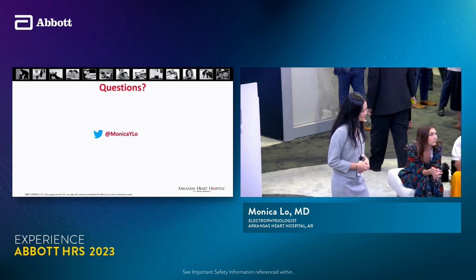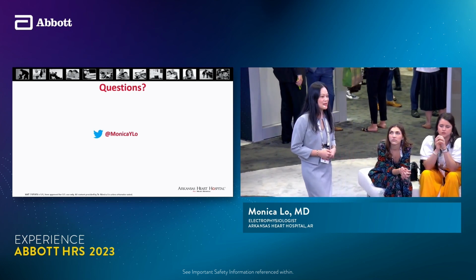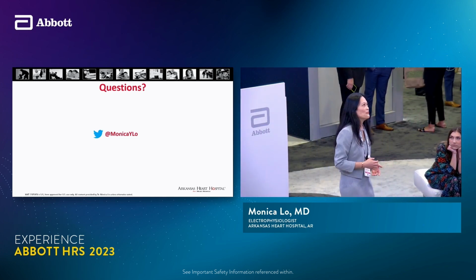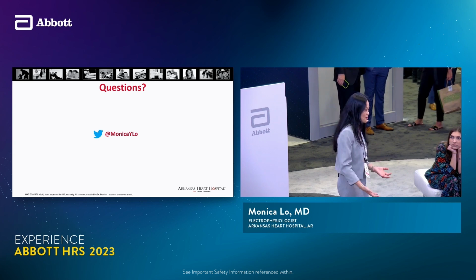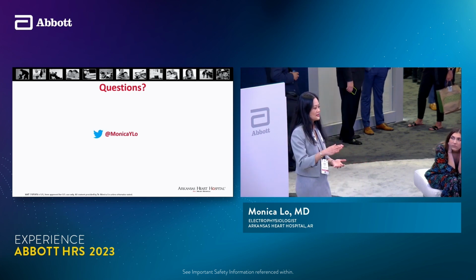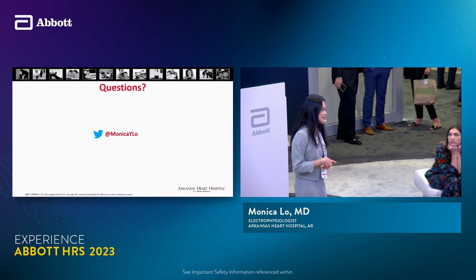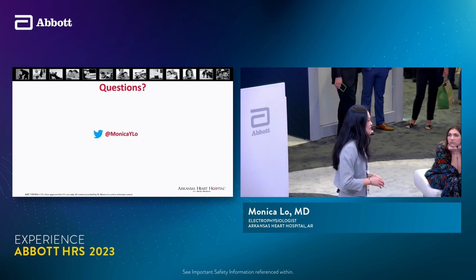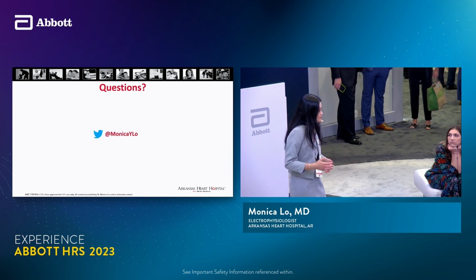What is your long-term follow-up plan and strategy with these Amulet patients that you're doing? So we're going to be doing a follow-up study, but basically what I do is we do a 45-day TEE. But of course, from other studies and other experience, we see that endothelialization really doesn't happen until, kind of like a stent, right, 3-6 months. But we still do a 45-day TEE to look at the seal, and I do DAPT for 3-6 months. And I think there is some variability in practices, but CATALYST will tell us more.